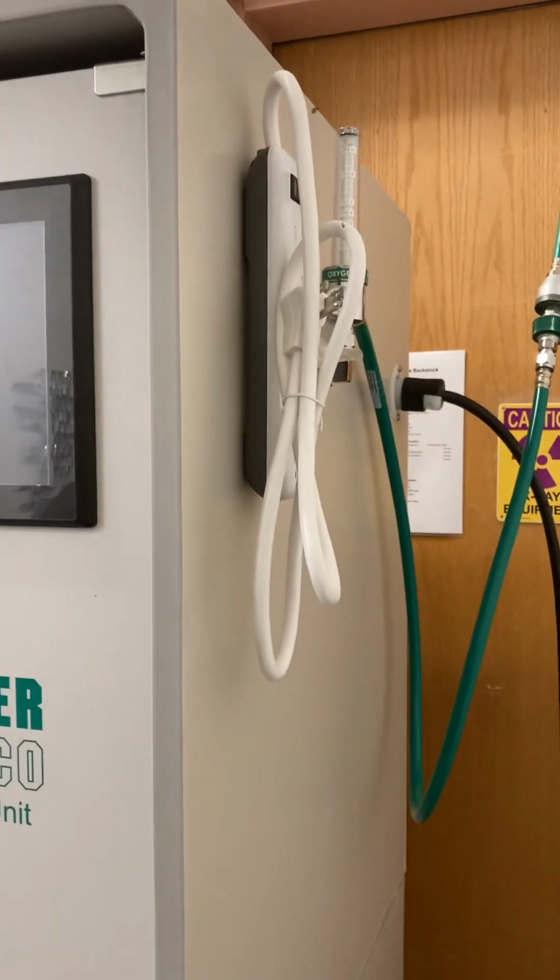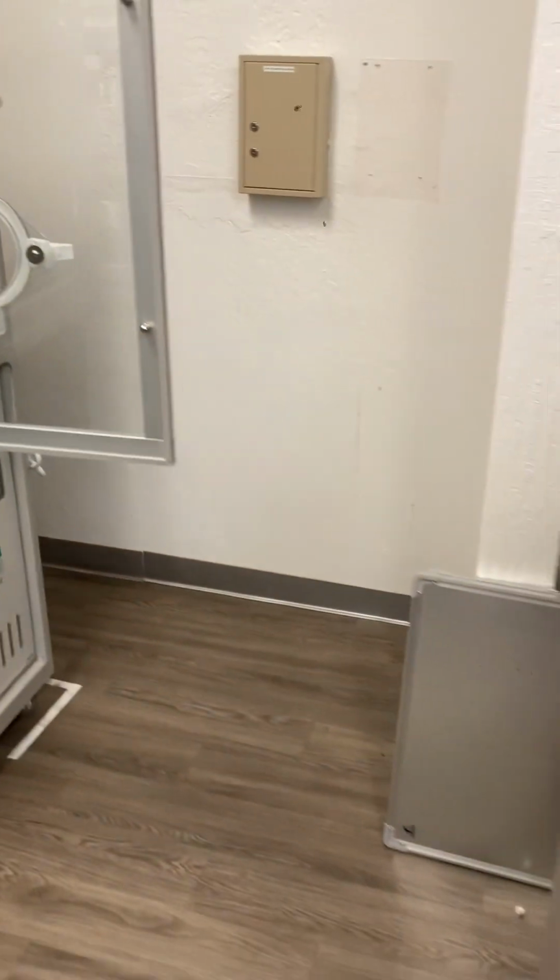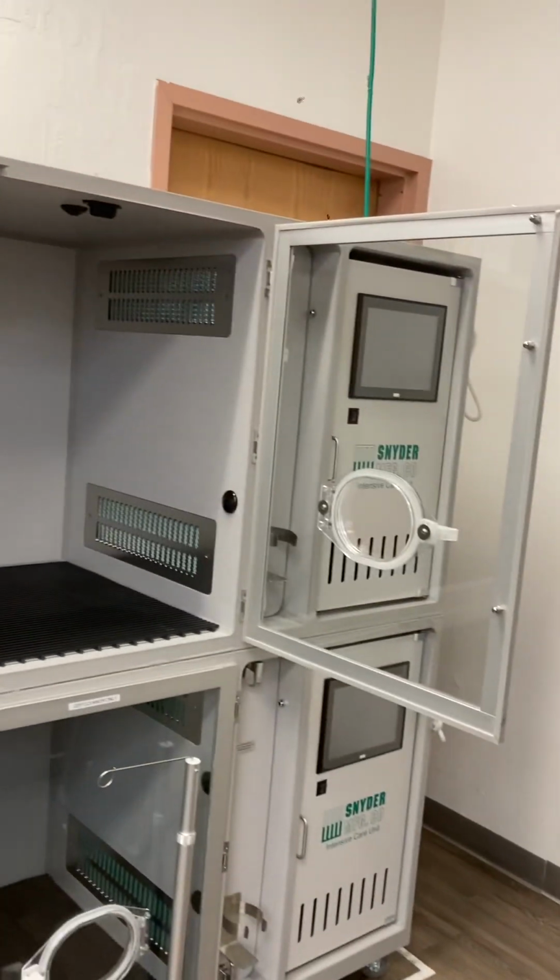Okay, so before getting a patient set up in here, you need to open up both compartment A doors as wide as possible. 2 little latches, fling them open. Do this first, and then Daniel here will hold my phone.